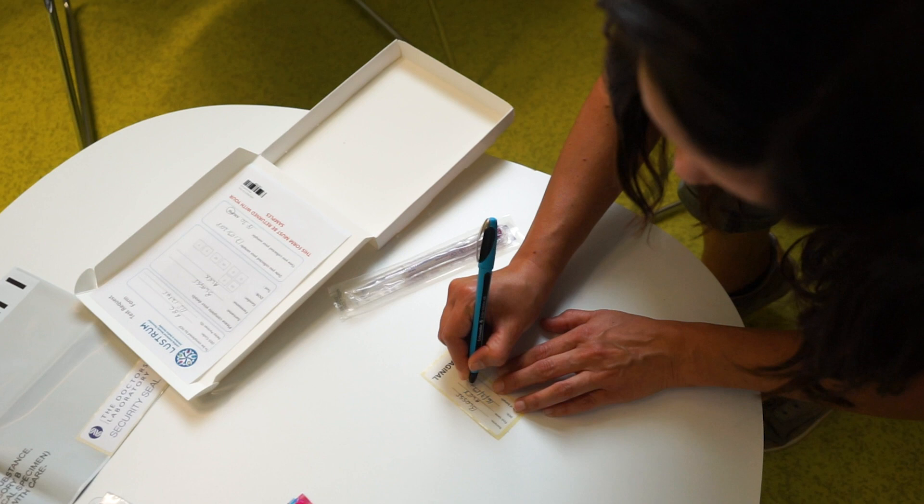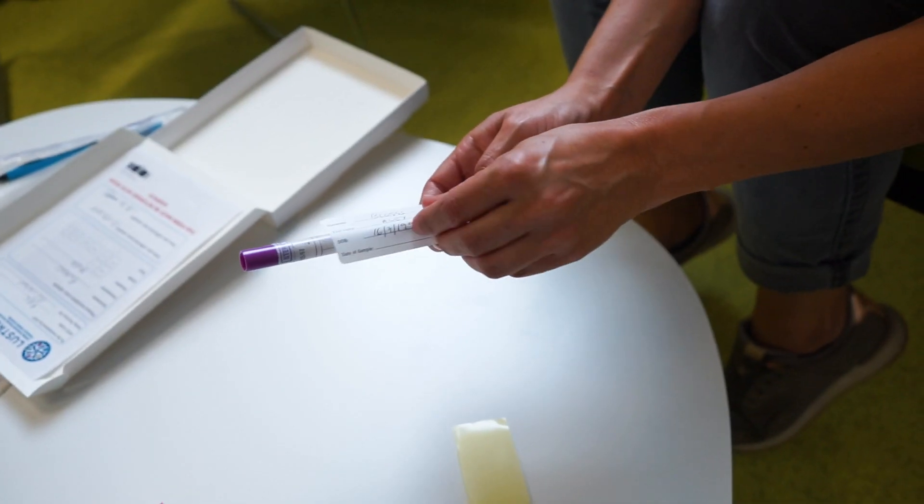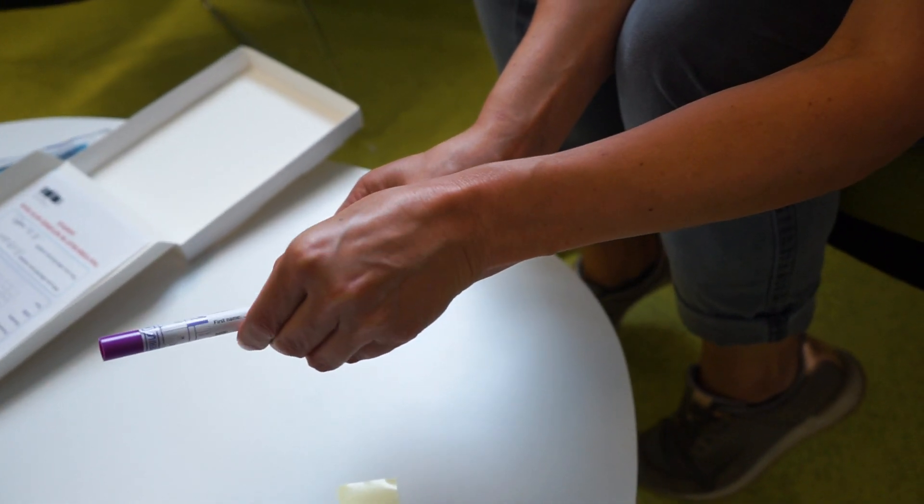Write your details on the label that says vaginal and on your test request form. Stick the label onto your vulvovaginal swab bottle before collecting your sample.